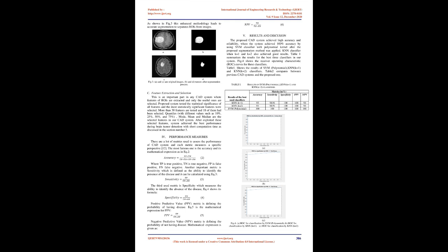The developed system used the following methods: segmentation using k-means clustering, feature extraction using discrete wavelet transform, DWT, and feature reduction by applying principal component analysis, PCA. The 2-stage classification was implemented using a support vector machine, SVM. They achieved 100% accuracy. However, they mentioned that the reliability of the system was limited due to the small size of the used datasets.